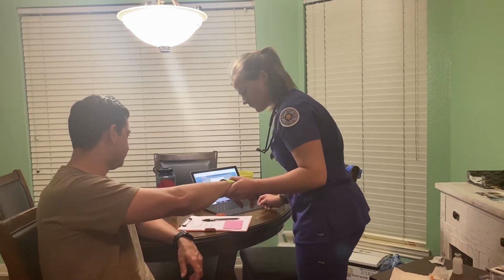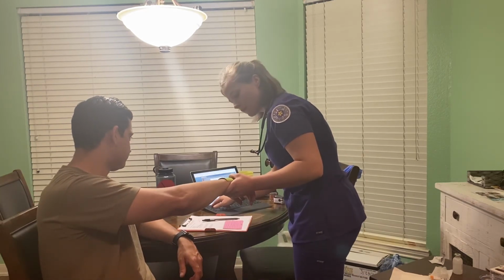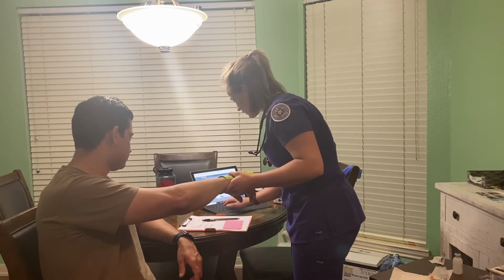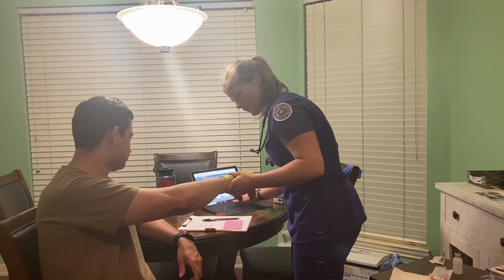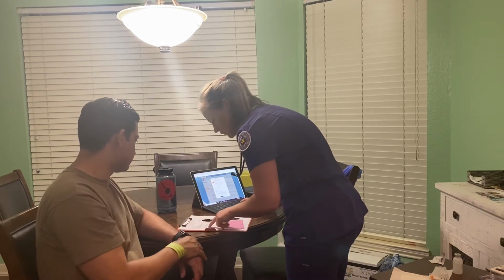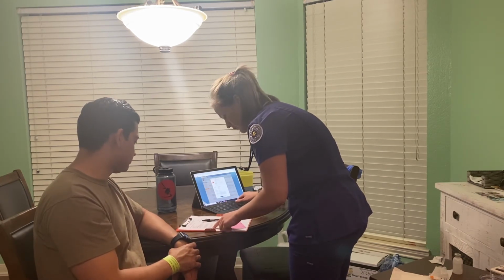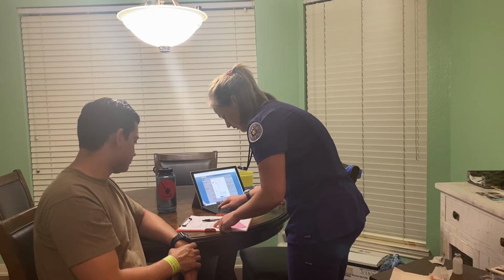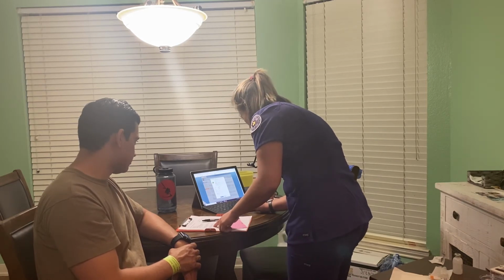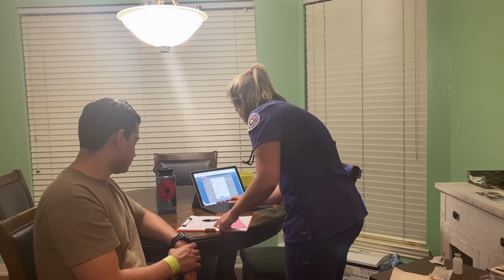Okay. Click it. 611169180. Okay, and the medication is D93D8A77D47F. Okay, we got the green light, so we have the right patient. 0730.